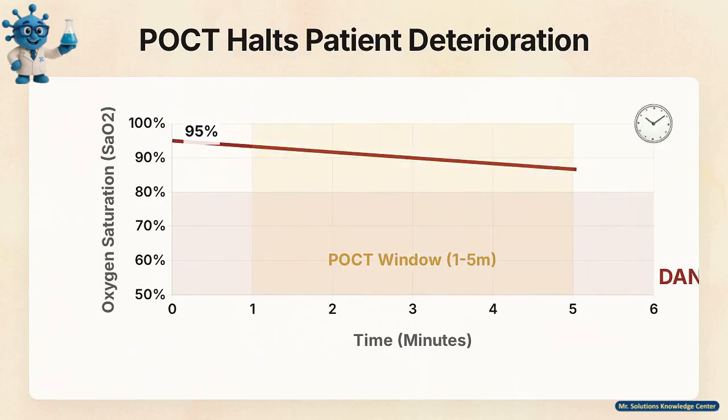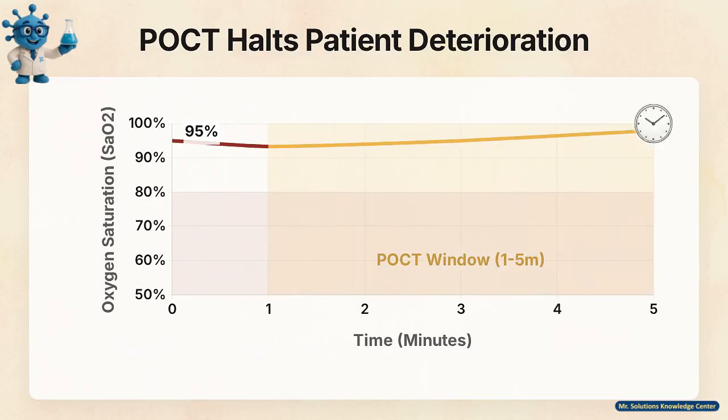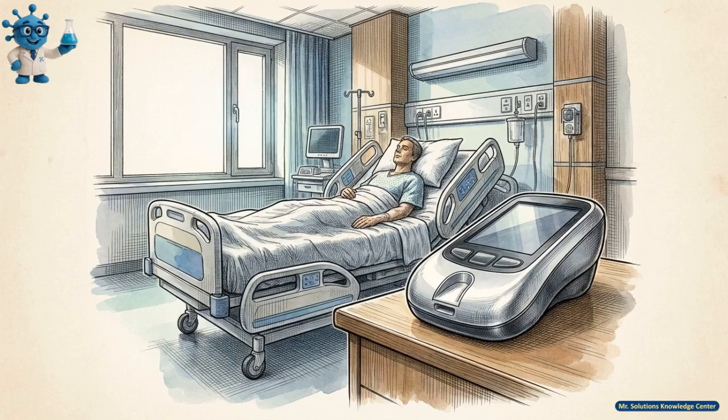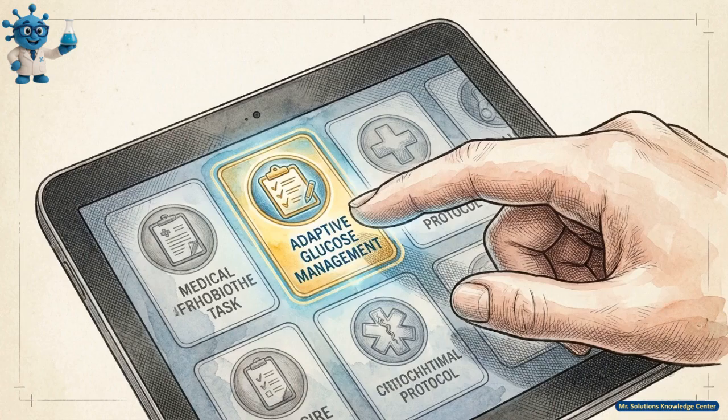Today, point-of-care testing reduces that wait to between 1 and 5 minutes. Modern handheld analyzers require only 95 microliters of blood, about 2 drops, and process the sample directly at the patient's bedside. By moving the laboratory to the bedside, these devices eliminate therapeutic delays. Rapid blood gas analysis provides the immediate clarity required to target treatment plans without losing critical time.